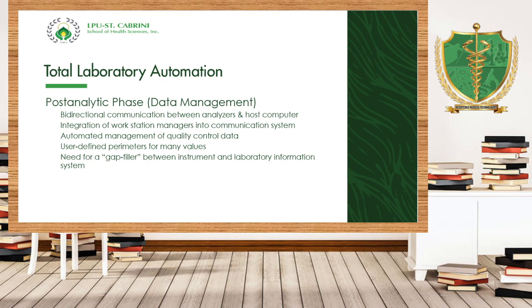Okay? Post-analytic phase includes the data management. How are we going to release the result? Automated management of quality control data para mas mabilis yung pag-gather, pagkuha ng data, pagkuha ng sample, pagkuha ng result.